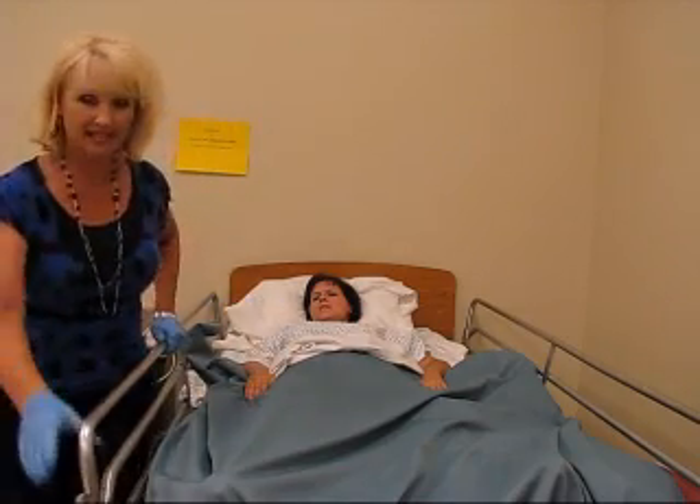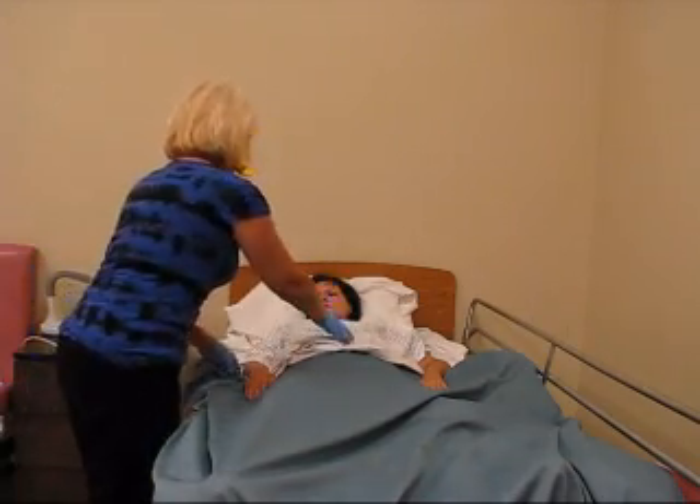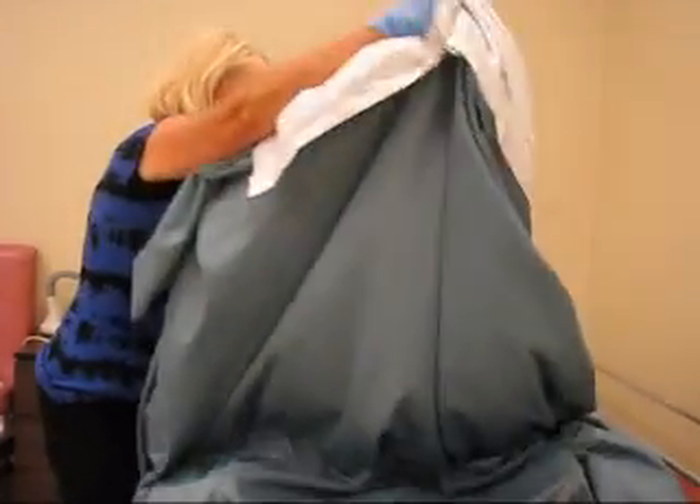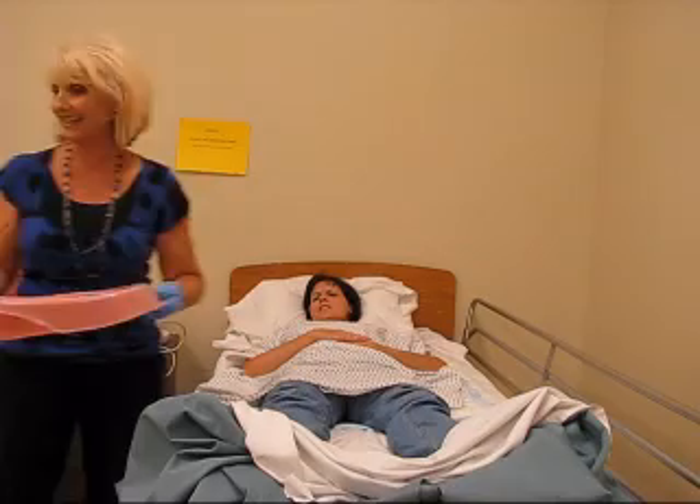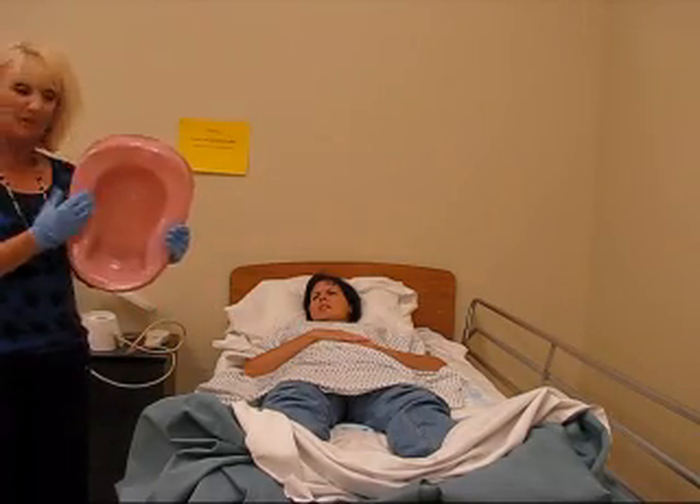Okay, hang on a sec here, Mrs. Lindsay. Can I eat that? Now, Mrs. Lindsay is quite — oh, two bedpans here in the bed. This is great. This is a regular bedpan.